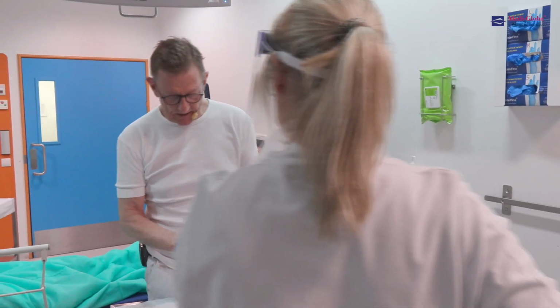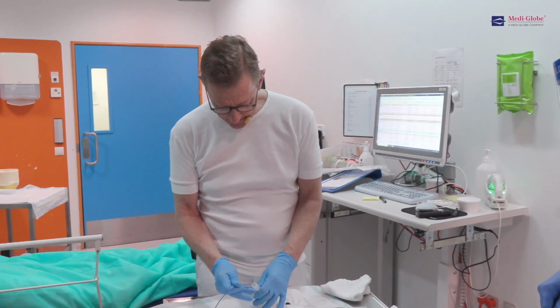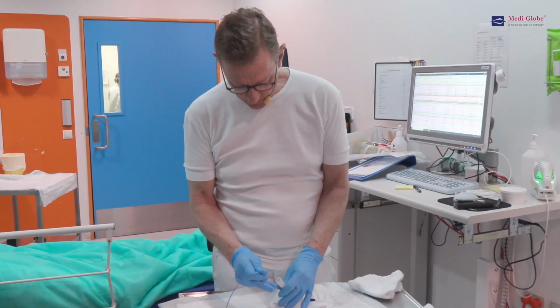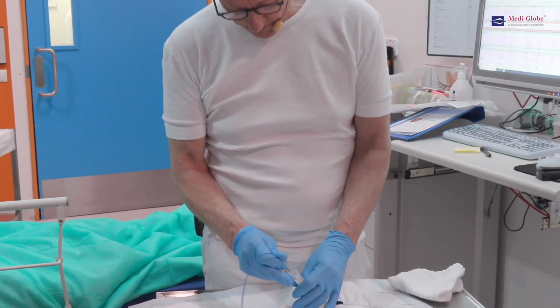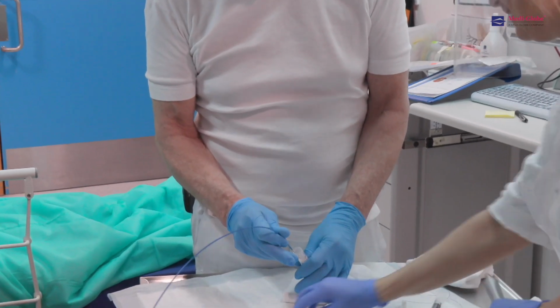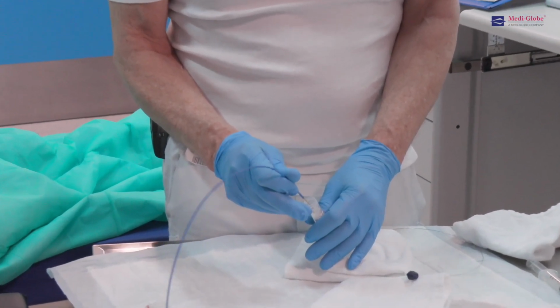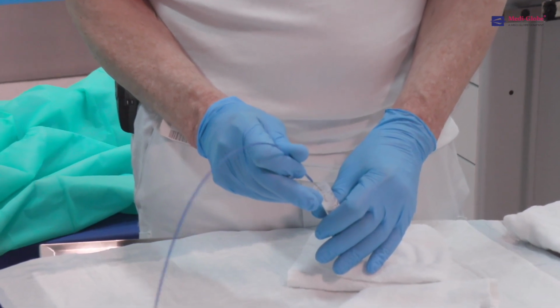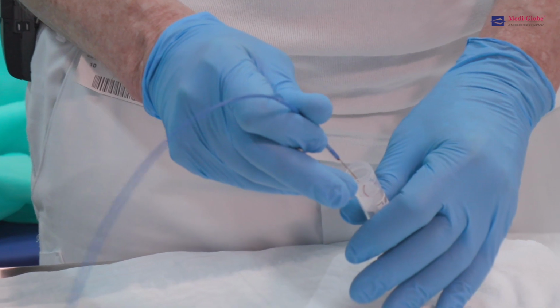So again, the needle tip coming out, and we will expel the material. Again, in most cases you can expel it, but if there are big cores inside, then it may be blocked, and then the stylet is to prefer.